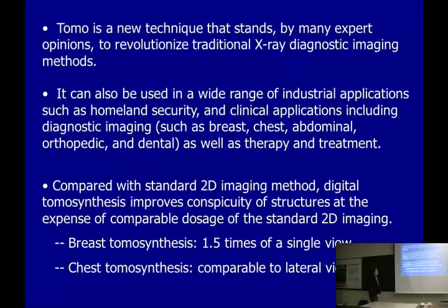So it can also be used in a wide range of industrial applications, for example, homeland security, for detection, and clinical applications like breast imaging, chest imaging, abdominal, orthopedic, and dental. So wherever traditional X-ray can be used, three-dimensional imaging will also have a very bright future.